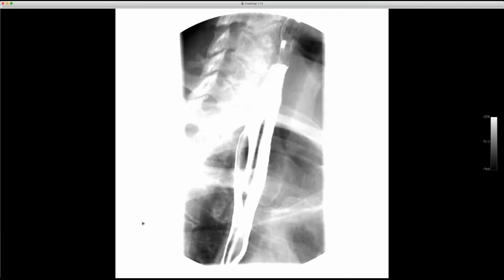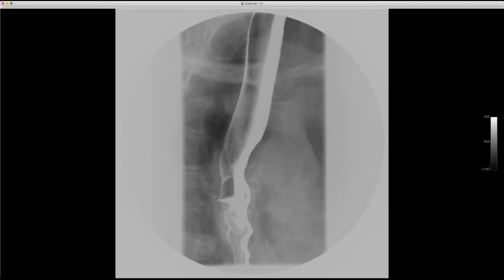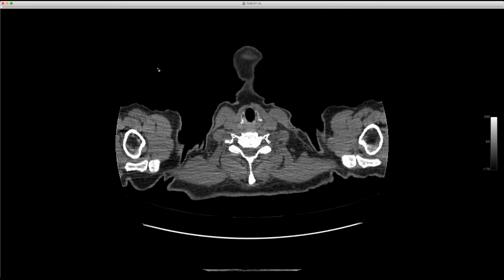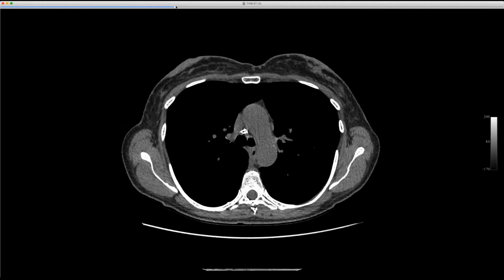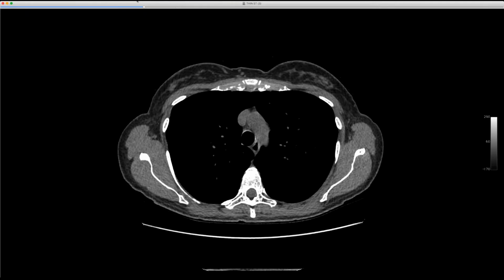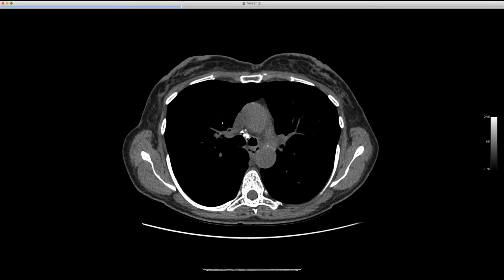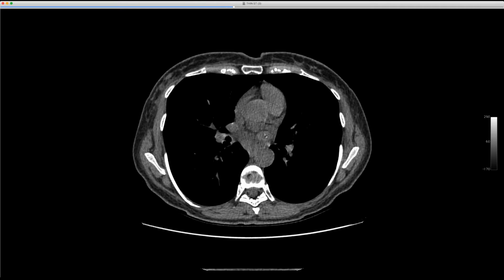And then I think there were some prettier images. Let's go a little bit lower. There you go. So there you can see that diverticulum with air in it now too. And there are those calcified nodes. So this is a beautiful example of a traction diverticulum, which is traditionally described in the setting of tuberculosis. I'd only seen it once, as a resident in the teaching file at the University of Washington, of a TB case. And I came across this case because she was referred to thoracic surgery, and they ordered a CT. All it shows is there's the esophagus, there's this big calcified blob.